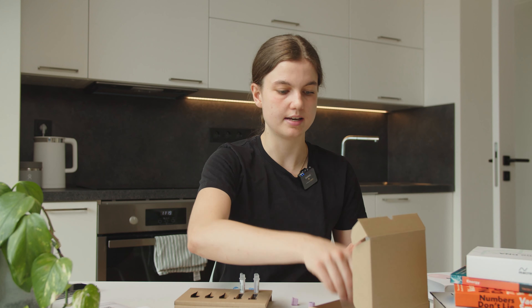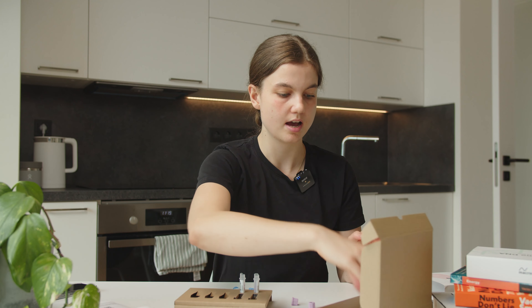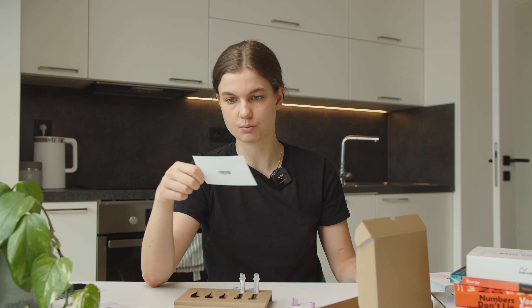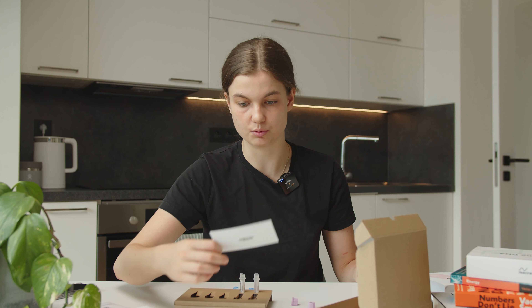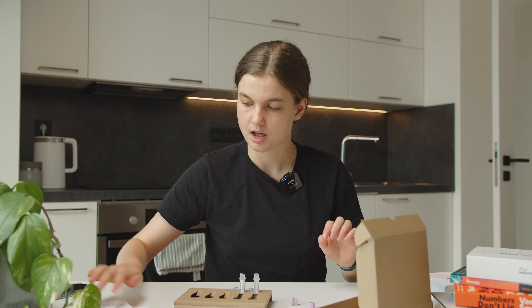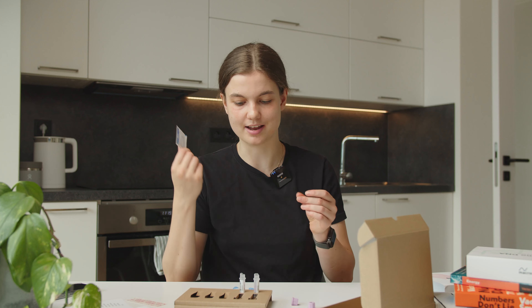Then we have a plastic bag for the samples, and a lab card which we need to fill in — we'll need to enter the time on it afterwards. And then we have a bandage and an alcohol wipe.